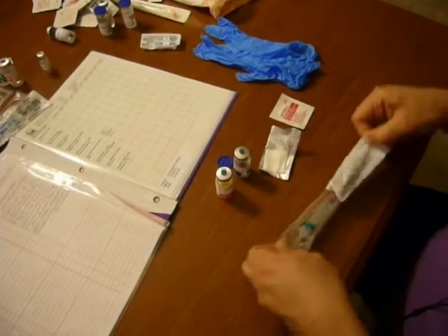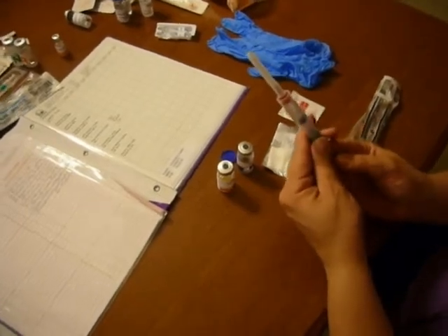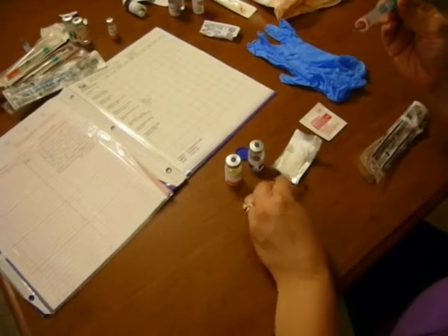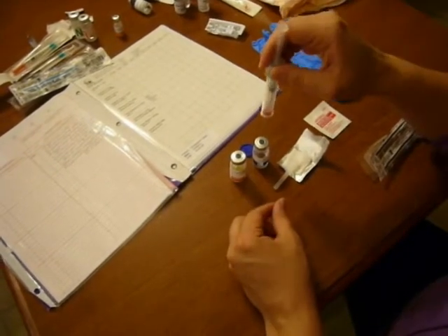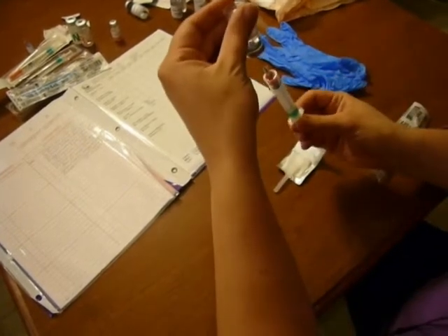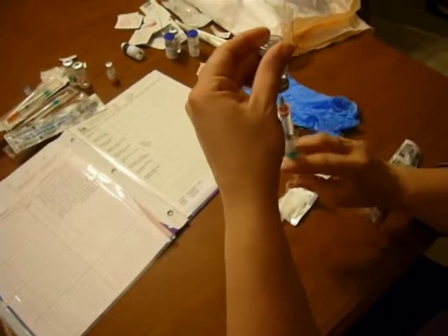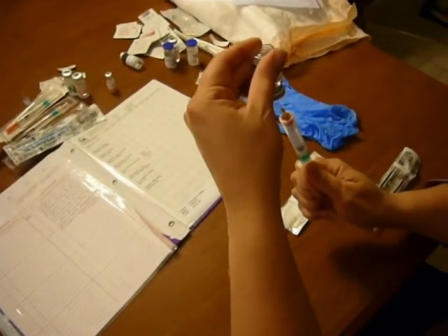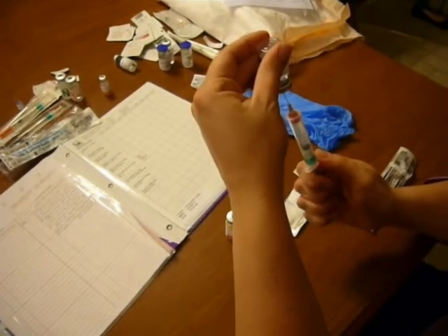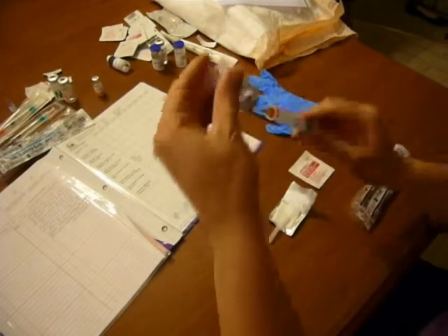I'm going to get the syringe out and the first thing I need to do is make sure that I draw up enough diluent. The order is for two cc's, so I put my needle cover down in the sterile field, draw back to two cc's, put two cc's of air in, and flip and draw out two cc's of diluent into the syringe. Now because this needle is very big and long with a large gauge, there will be a big air bubble, so you may have to go back and forth using turbulent flow and tap out the air bubbles when you're done, so I'll draw up a little extra.